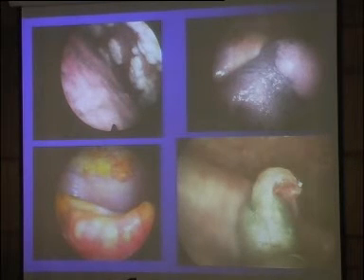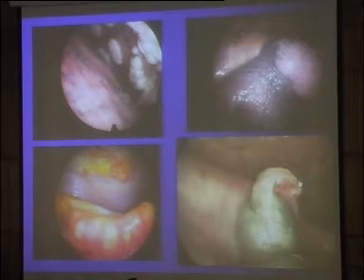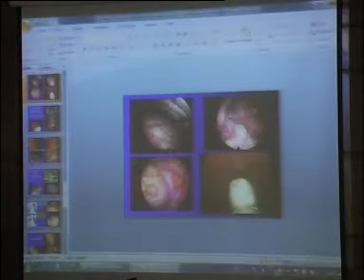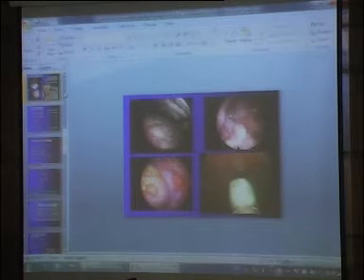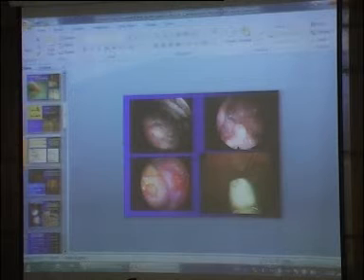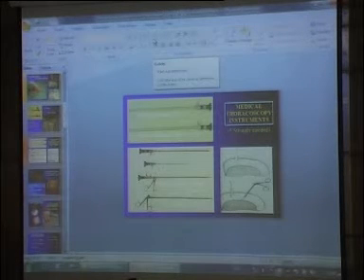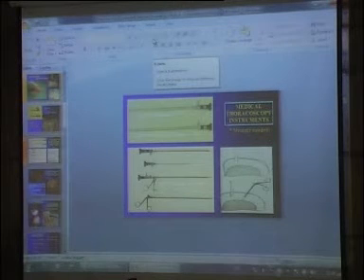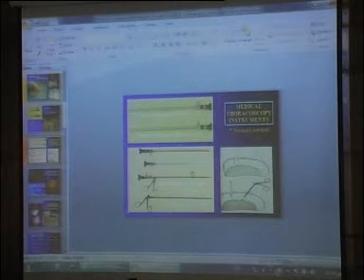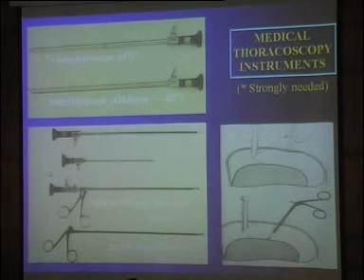Yes, madam. We are fixing the forceps, but we are moving the telescope. What do you mean? It's optical. In this case, I use optical biopsy forceps. I mean, we are not moving the forceps. You can move the forceps like this if you want, and we peel like this. No, she means the vision. She doesn't understand the optical. Yes. It's this forceps actually.